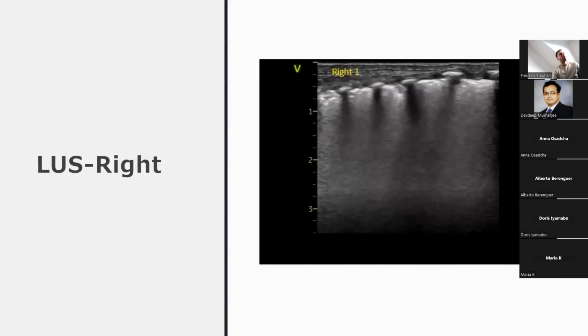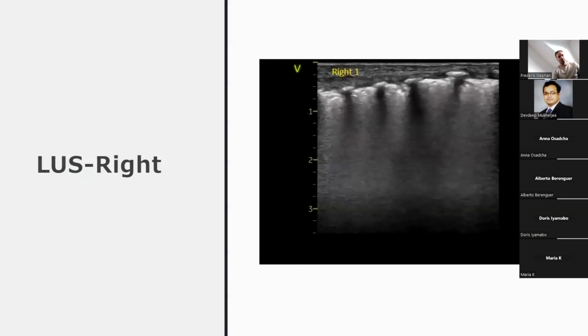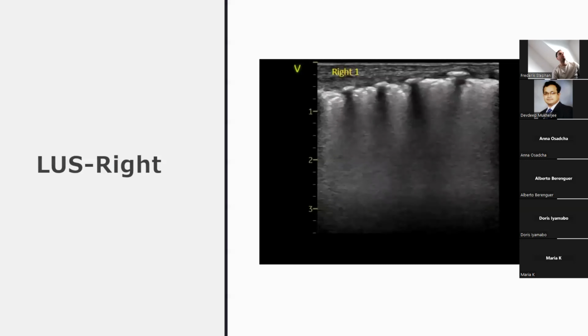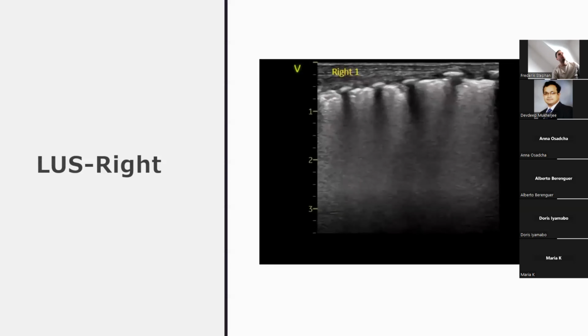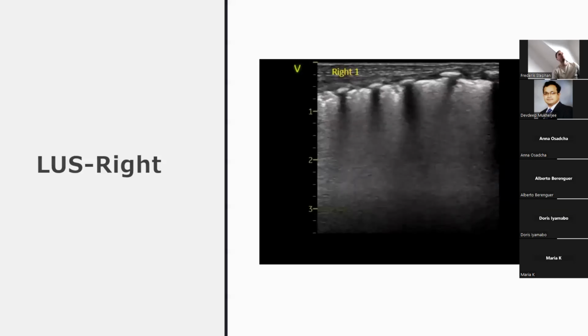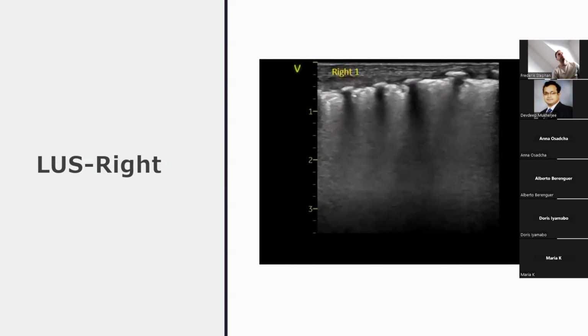Yeah. So just for everybody, with the ET tube, if you've got sliding of both the right and the left lungs, provided the baby's not spontaneously breathing, it's an indirect marker that the tube should be in situ. Now, naturally, it's very much like everything else. It needs to be clinically correlated. You need to look at loops on the ventilator, but just be very careful. The reason I'm using this as a teaching point is if a baby is spontaneously breathing, your ET tube could still be dislodged and you will still get sliding. So just be very, very careful.